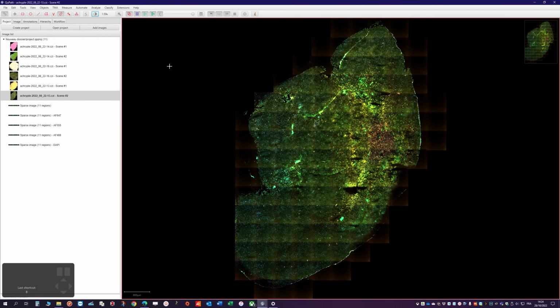Let's say we want to apply our script on a specific region. As always, you can define the regions like you want, for instance a square here, and then you can refine this region by using different means. Here I will use the wand tool and the Alt key to, sorry, why does it work?